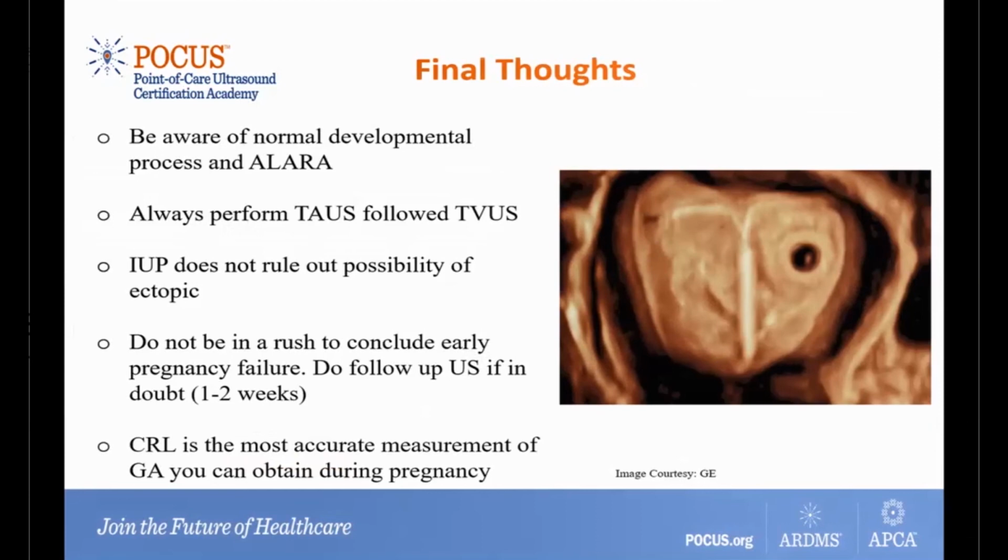So here are some final thoughts. We should be aware of the normal developmental process and the appearances of different structures as the first trimester pregnancy advances from 4.5 weeks onwards. We also want to consciously follow the ALARA principle, which stands for as low as reasonably achievable.